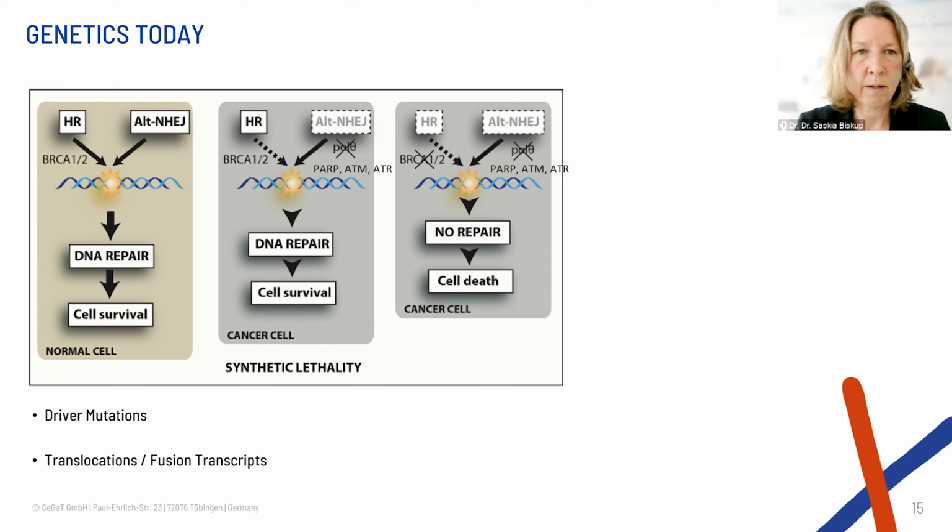And here we are working on the immunohistochemistry, like I mentioned, with the Maxima platform, with staining of antibodies on the tumor slide. We try to identify not only the heterogeneity of the tumor, so you can also imagine that parts of the tumor can be driven by EGFR and others are maybe primarily driven by another variant. If you don't consider that the tumor is composed of different types of driver mutations, you might be too short-sighted if you focus on one, because then you select for the ones that are resistant because they are not driven by this particular mutation.